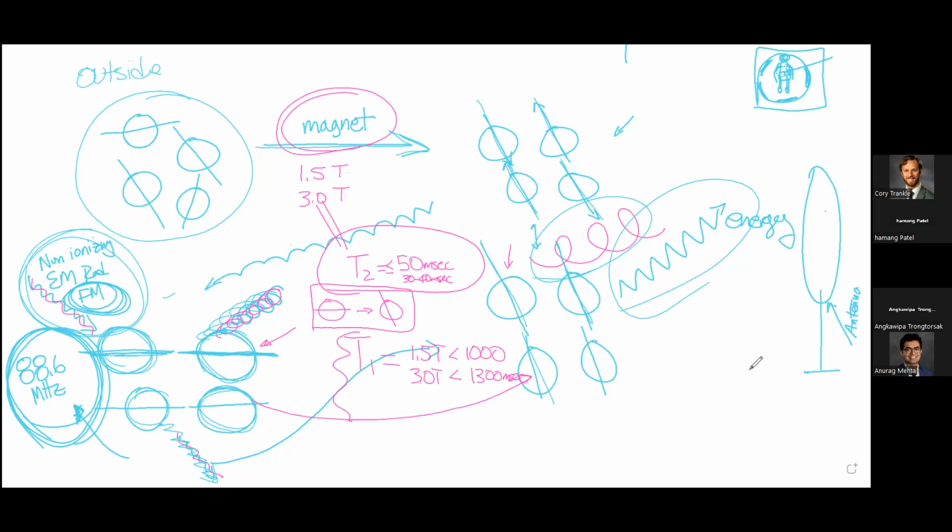We can time this process, and we look at the T2 time right here by this quick movement from this orientation back to this.